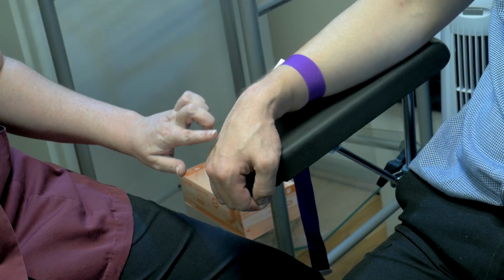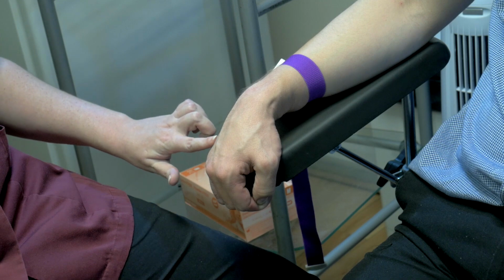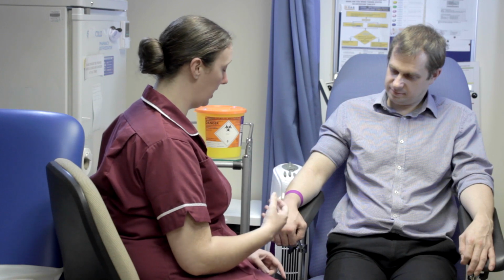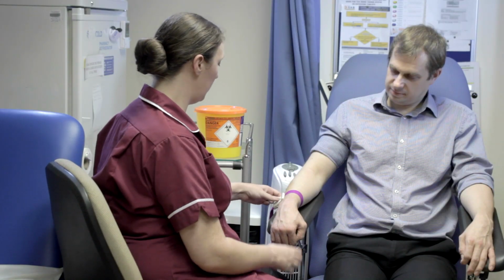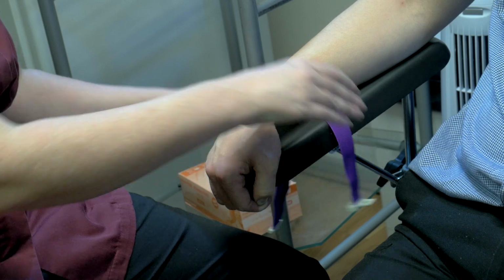Then I'm going to have a good feel for various veins on the hand. This patient has great veins on the hand. We always palpate using our fingers, not our thumbs, because our thumbs have a pulse in them. So, I've discovered what vein I'm going to go for, so I'm going to release my tourniquet.